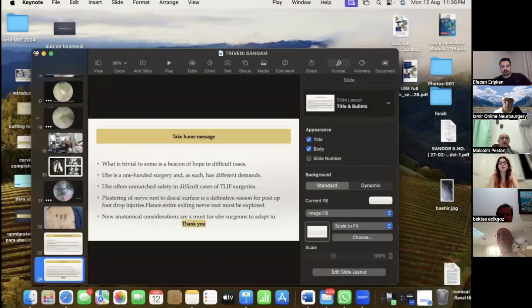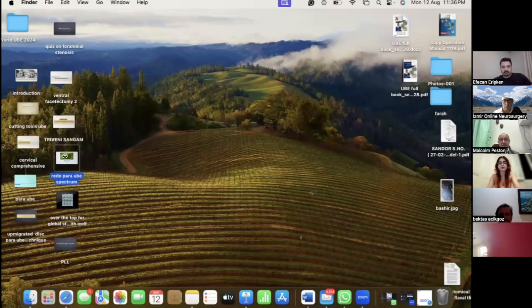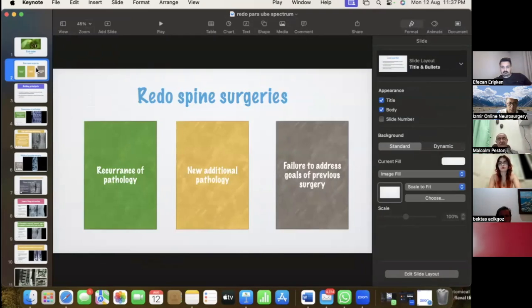I hope you have enjoyed this talk. Let us come to the world of redo spine surgeries. Obviously, when you are a spine surgeon and you've been doing endoscopy for 8 and 10 years, you are going to have failures. You're going to have your birds coming back to roost. You're going to have other people's problems coming back to you. So redo spine surgery is a whole new world. Learning curve for me too, and learning curve for you, my dear friends.